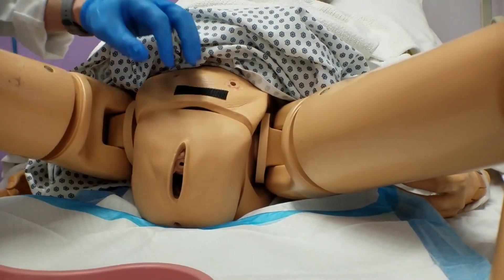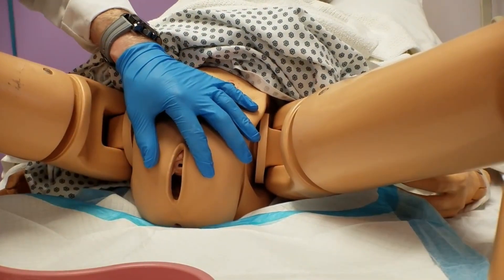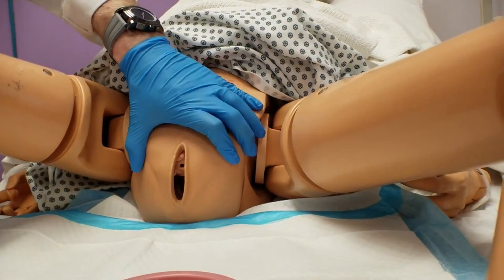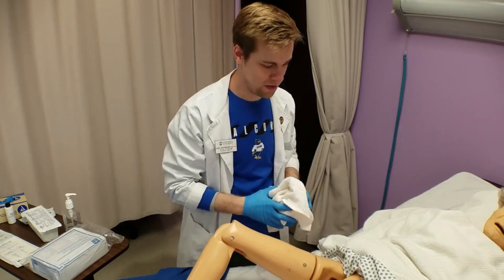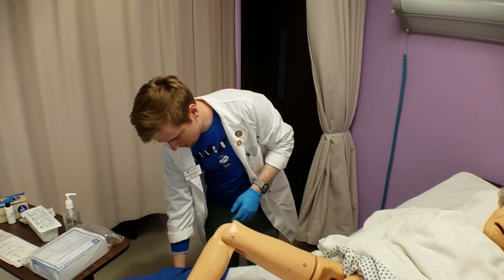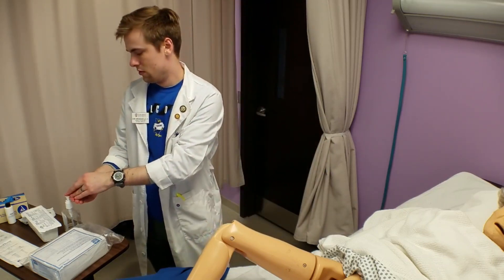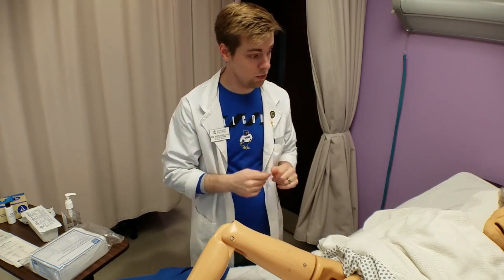Inspect the perineum for erythema, drainage, and odor. Use a penlight to visualize as needed. Use soap and water on a washcloth to remove gross debris as needed, and ensure that you wipe anteriorly to posteriorly to avoid moving contents from the rectum into the vagina or urethra. During this process, determine if you might need help with the catheterization — extra assistance may be needed if the patient is unable to cooperate or if extra hands are needed to separate leg, groin, or labial tissue with larger patients. When done, remove your gloves and wash your hands.